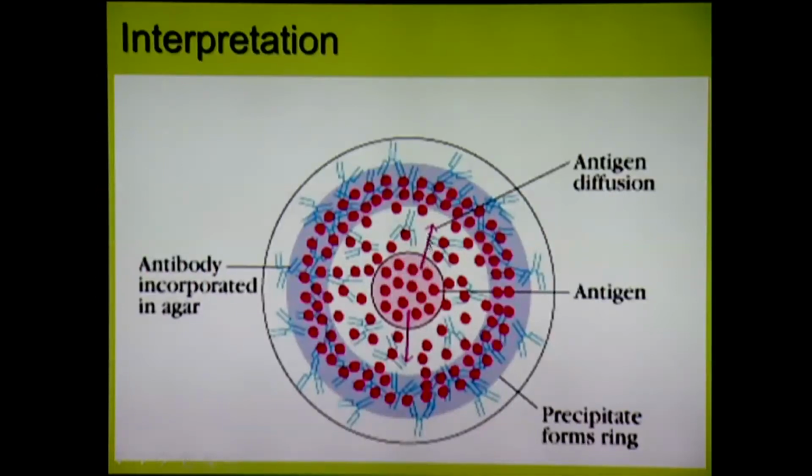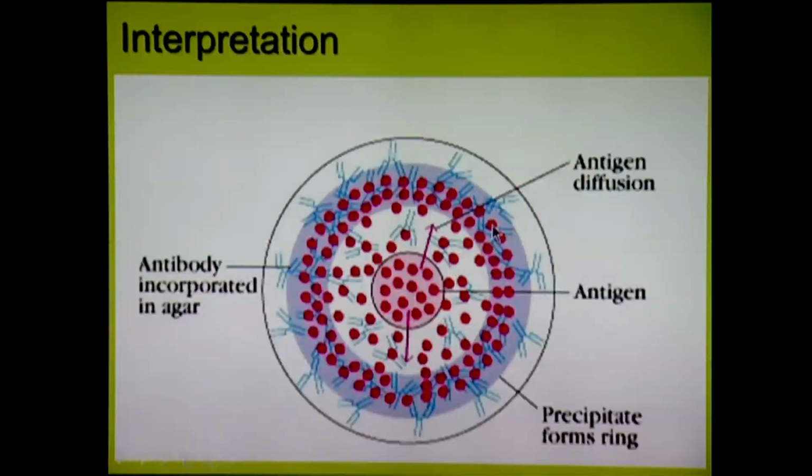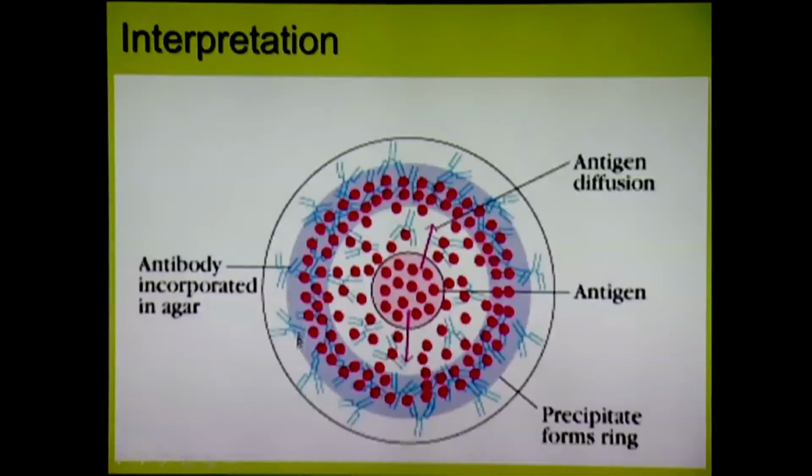As we are adding antigen in the well and antigens are moving radially from the well, the concentration of antigen will be higher in this zone initially. So at higher antigen concentration, no precipitation will take place. Now as the antigens are moving, their concentration decreases, and at this zone, after decreasing, the antigen concentration has reached its equivalence point. That is why the precipitin line is observed at this region, and the diameter of the precipitin line can be used to quantify the antigen concentration.